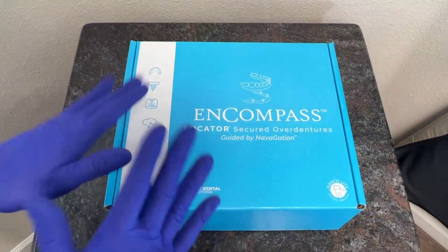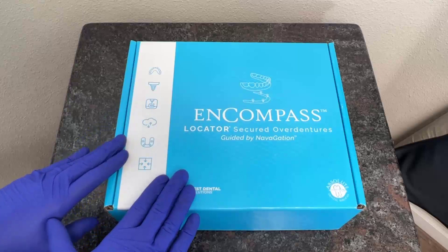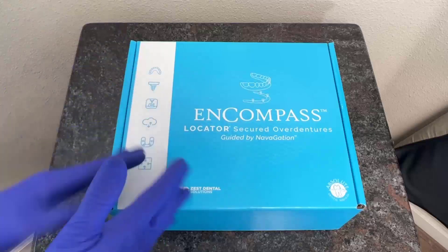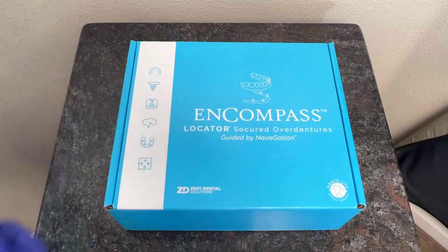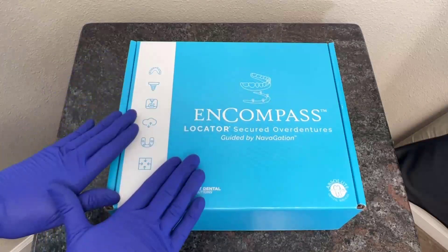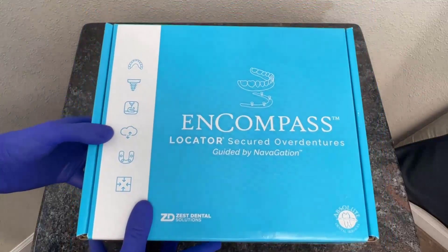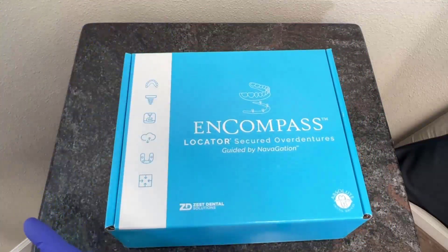Taking a look a little bit closer at the actual box for the Encompass solution, we can see here that it overall has a very nice and aesthetic appeal. Part of the reason for this is twofold. Number one, it just looks very presentable for me as a clinician — I feel like I'm receiving a premium product when I order Encompass. In addition to that, I can also go ahead and show this to the patient. It is an aesthetically pleasing solution that looks very premium, especially in my clinical practice where I will be offering this service as a premium product for my patients.